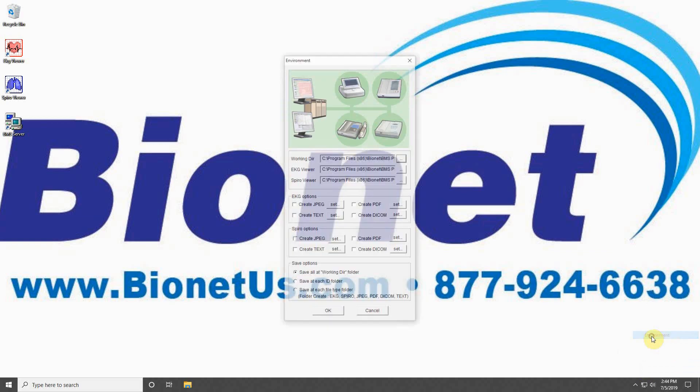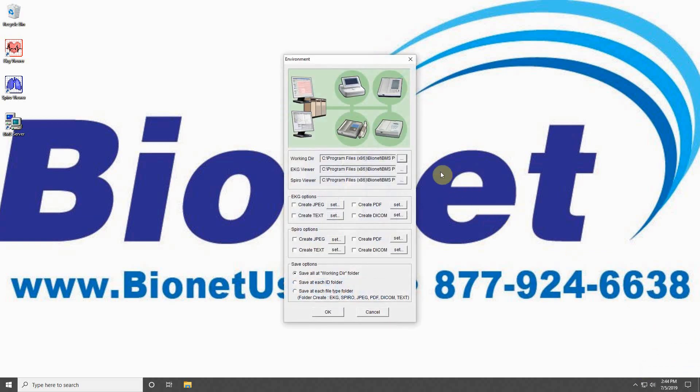The top field is used to define the working directory, or where transferred data from your machine will go in your computer. The folder location for this data is displayed in the field and can be changed by clicking the icon with three dots next to it.